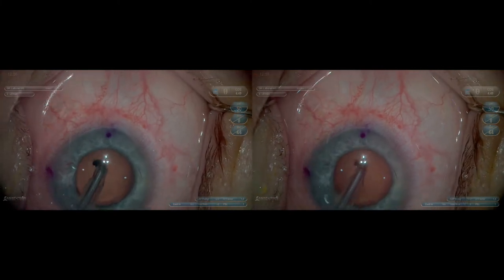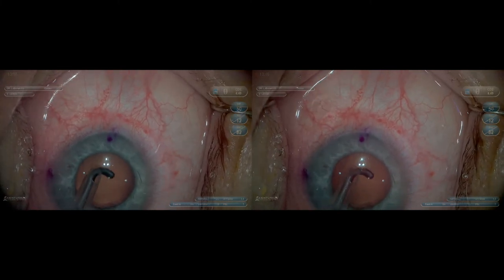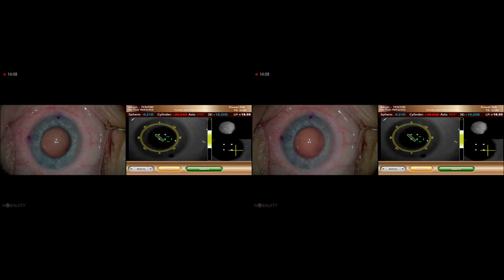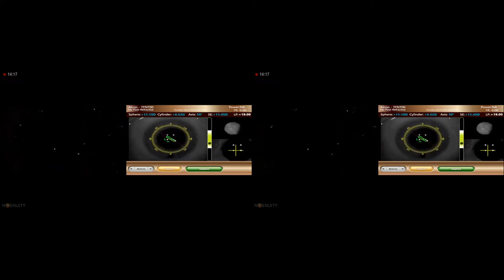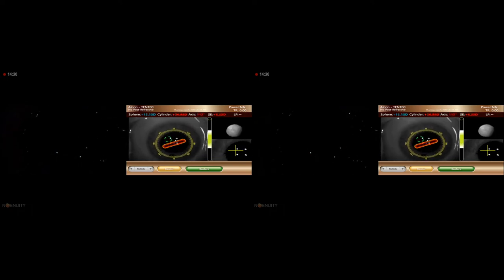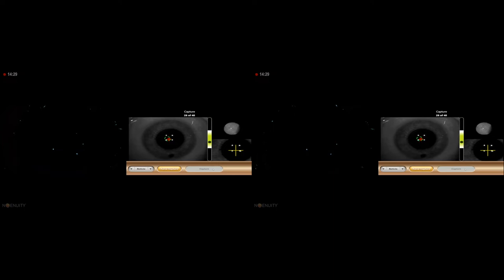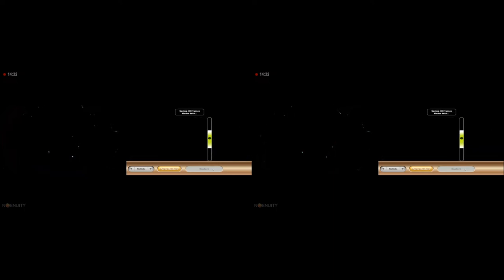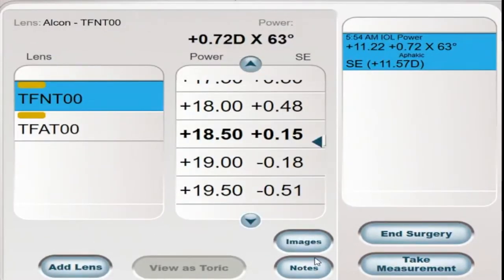During the surgery in the nuclear component, I'm often looking at the CDE to give me feedback that might impact some decision-making while I'm operating. The AURA is fully integrated, so my screen becomes split and I'm still working off the same monitor. Even though I'm wearing 3D glasses, the AURA is not in 3D — it's not necessary for that component. So without switching to a different monitor, I'm still looking at my same Ingenuity monitor.